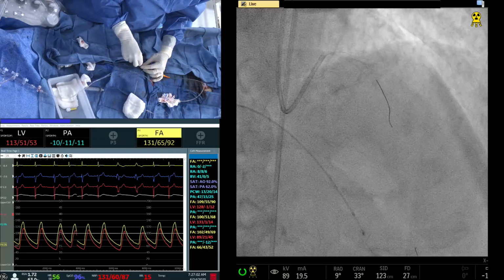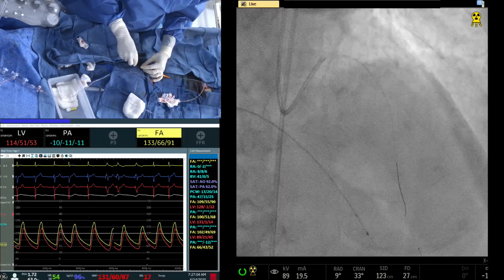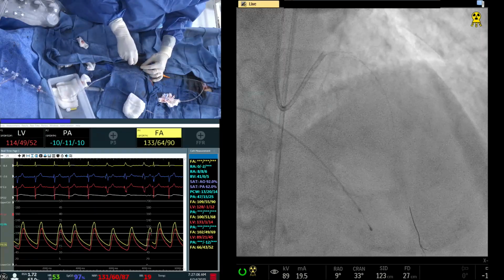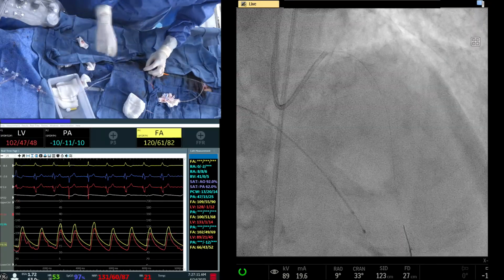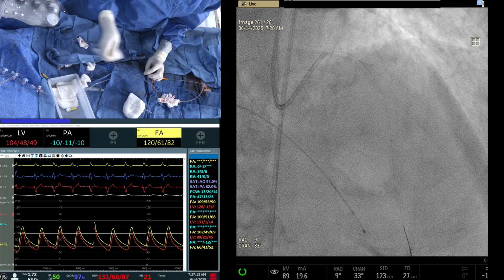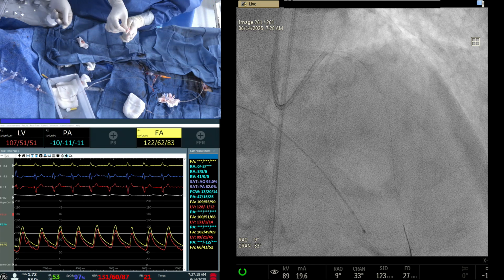IVL, absolutely, no question. People say in the calcific lesion, why can't you use more IVL? I say yes, if it's the same price as the balloon, we use it. Same here in America, balloon price is $200 and IVL is $4,500.